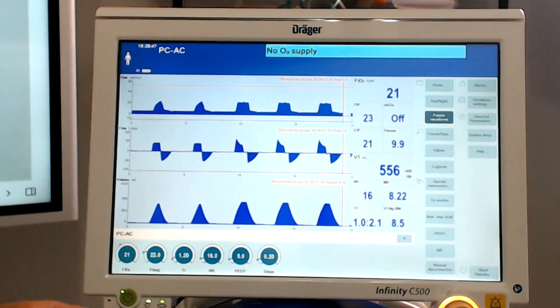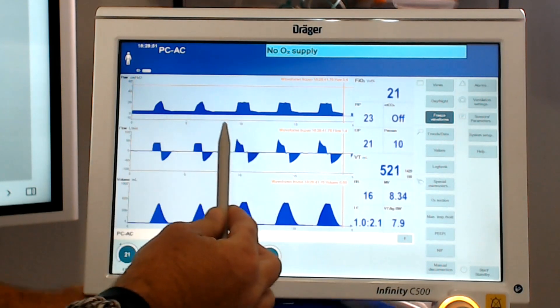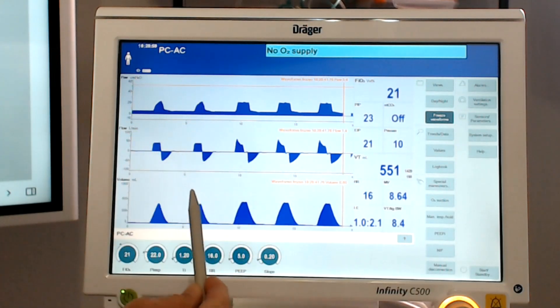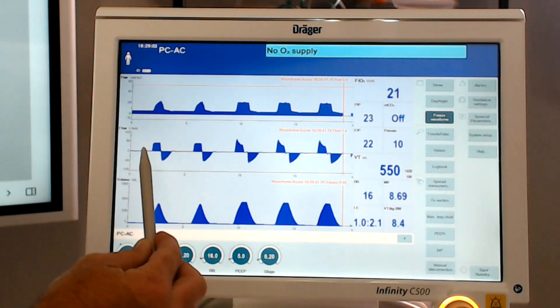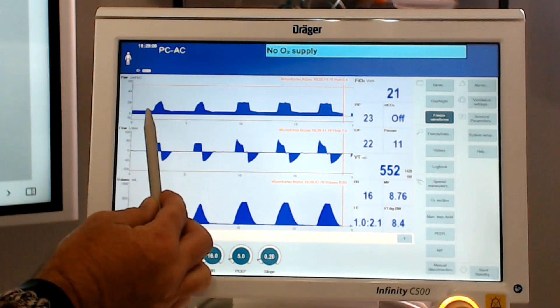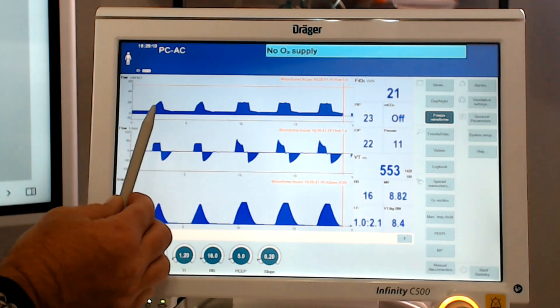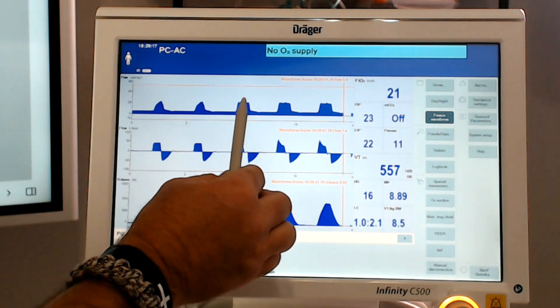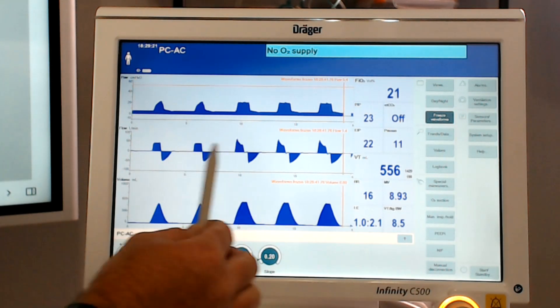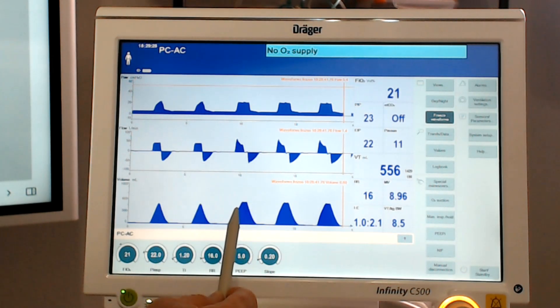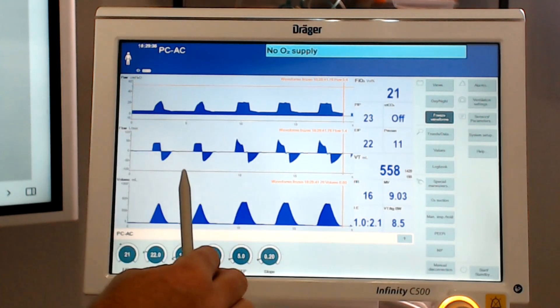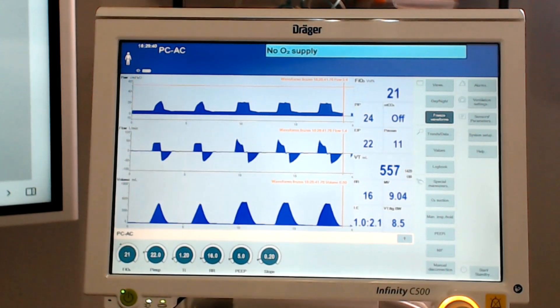I want to show you volume control side by side with pressure control. These two breaths right here were volume control — as volume goes in, square flow pattern with a slow rising pressure waveform. When we look at it on the pressure control side, you see a square pressure waveform — very different than in volume control. Square pressure waveform and decelerating flow pattern compared to a square. We see that our volume now is greater than in volume control because when we set a higher pressure, we're going to get more volume. That's how you compare volume control versus pressure control just by looking at the waveforms.